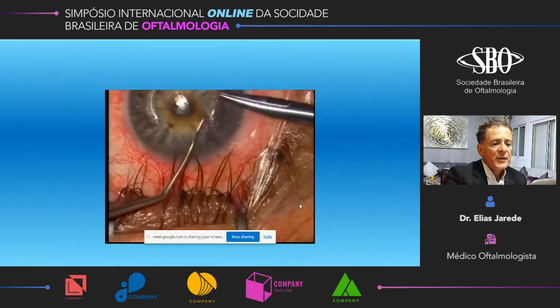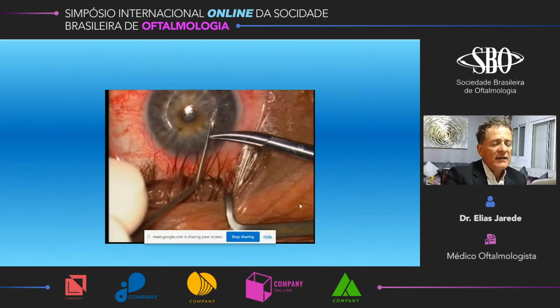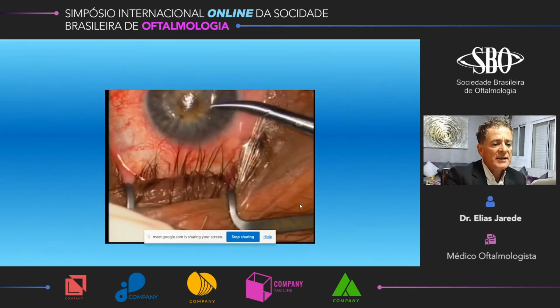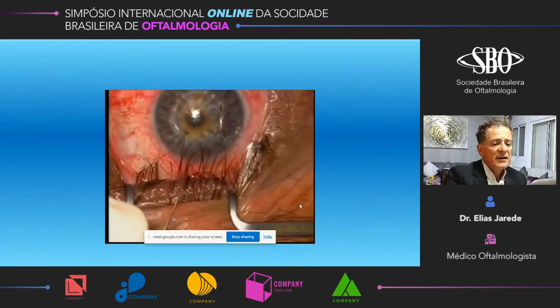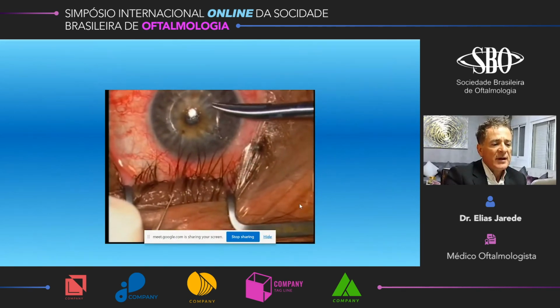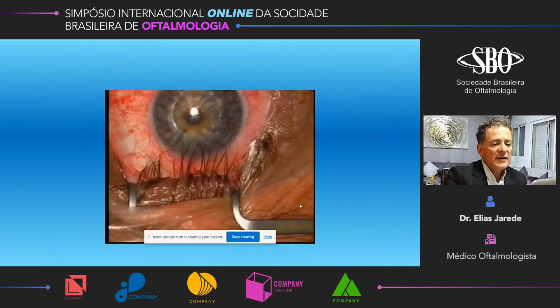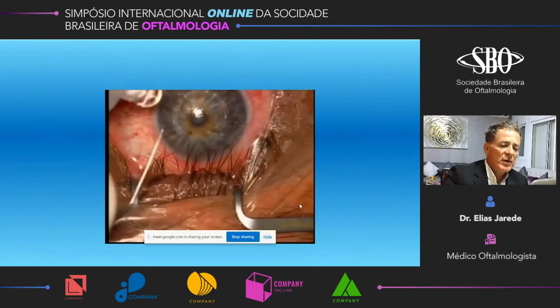to be. Again, I was mentioning that when I passed the first needle into the hole, I did not make a knot because I have to bury the stitch after passing it and reposition the ring into place. So here, after passing the two needles adjacent to each other, I make my knot and I can bury the stitch as well.